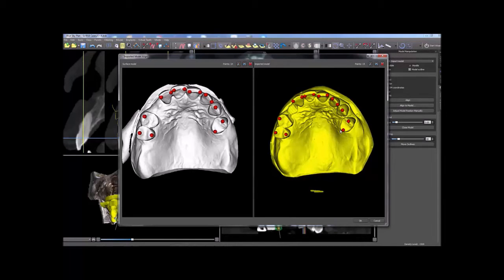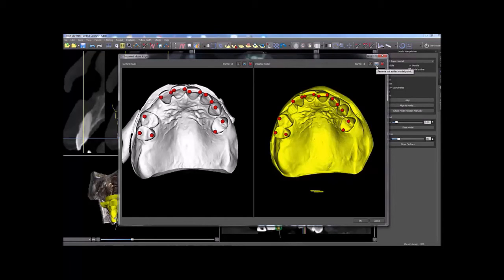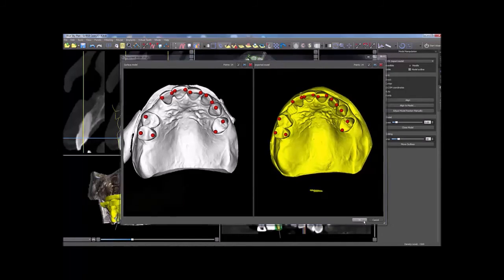Seven to ten point pairs should suffice. Release the Shift key in order to reposition the models as necessary. To remove the last points, click the undo icon for the relevant view. Click the X to remove all points in the view. Click OK when done.